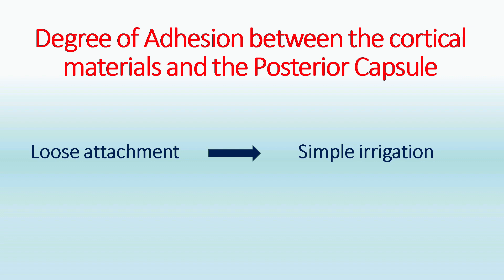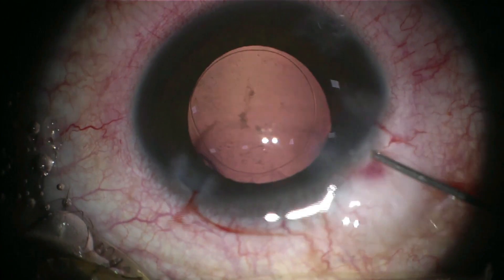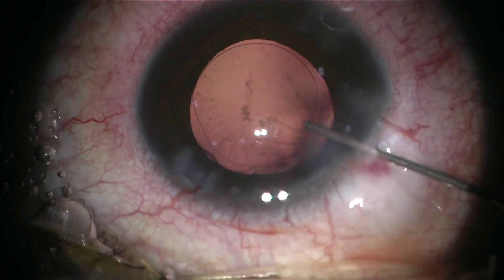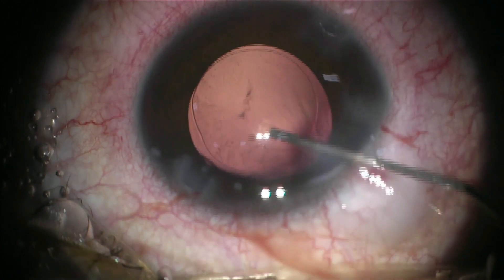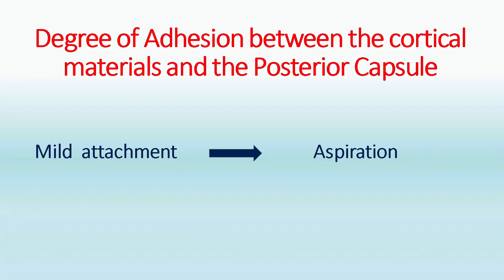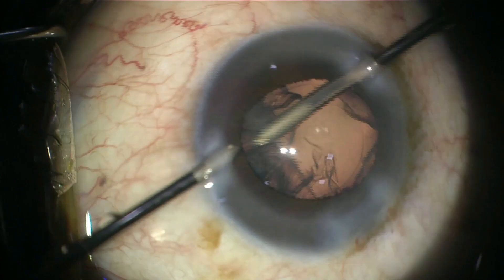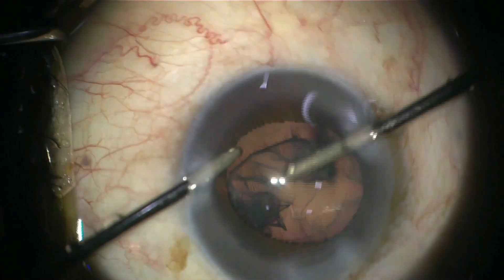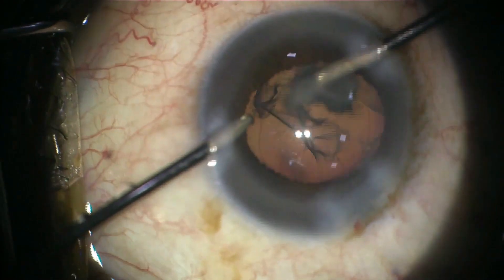Loosely adherent opacities can be effectively removed using simple irrigation. Mildly adherent cortex is easily managed with standard aspiration techniques.